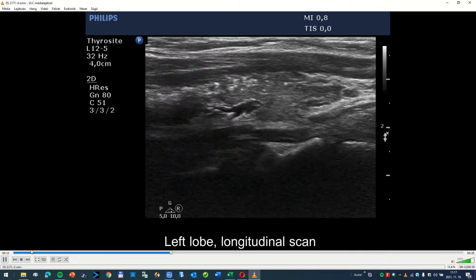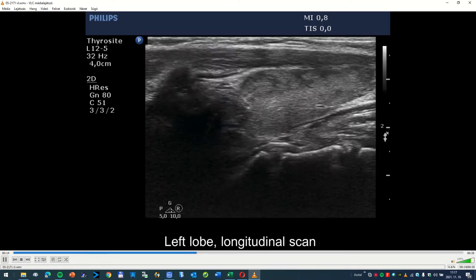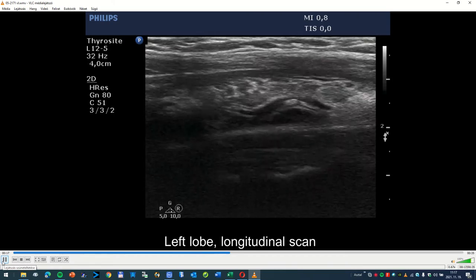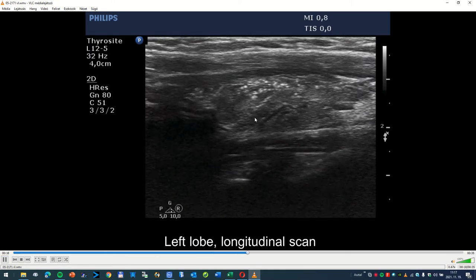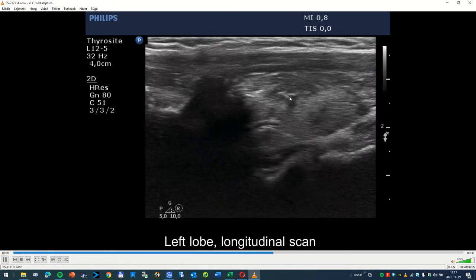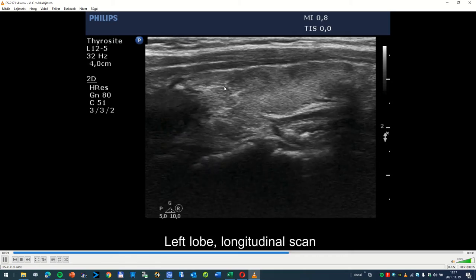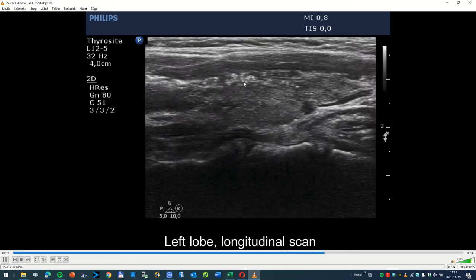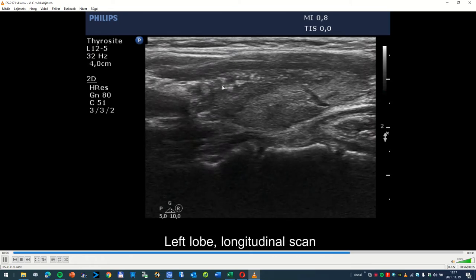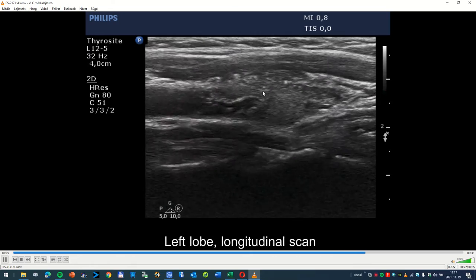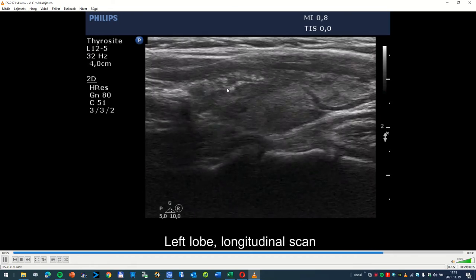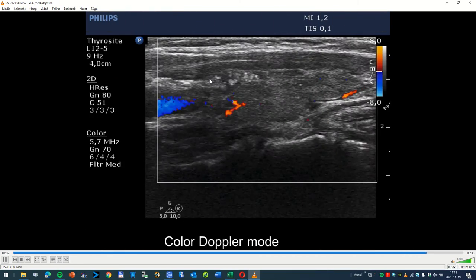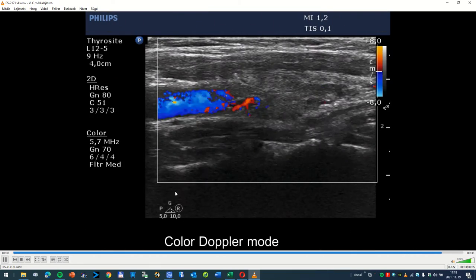So this is a very deceptive pattern. And it is not the rule — this is the exception. Most such thyroiditis cases with this pattern are papillary cancers. I had two or three among more than 20 such patterns which proved to be benign. So I think that despite the negative cytology, surgery should be considered if we face this pattern.